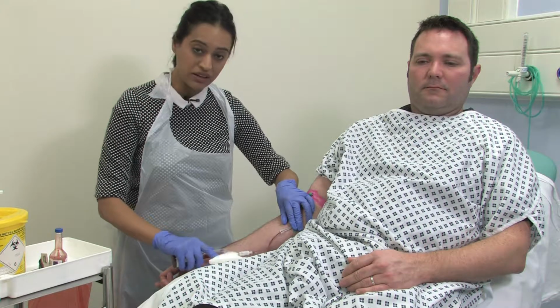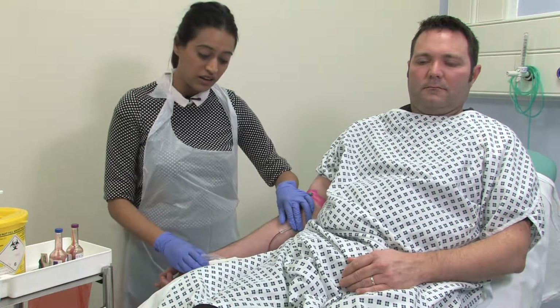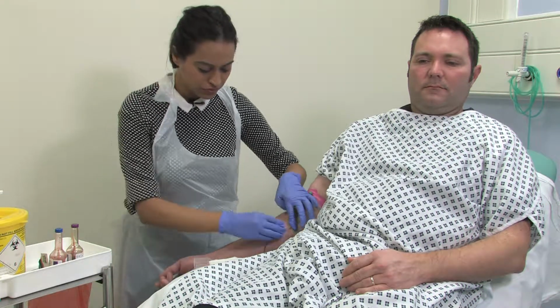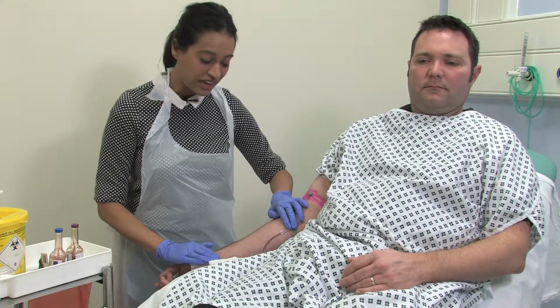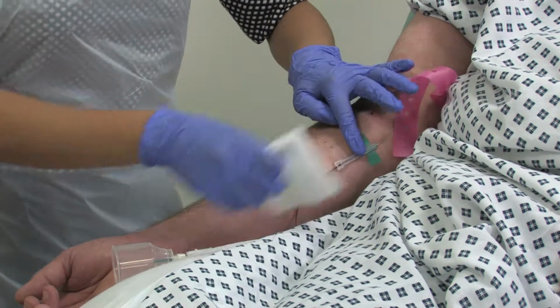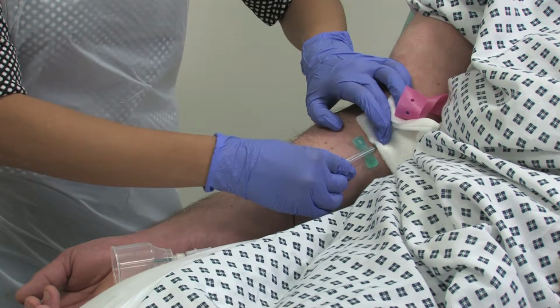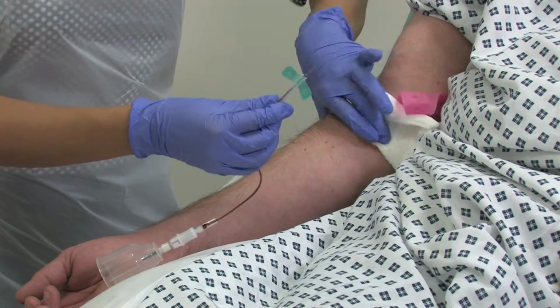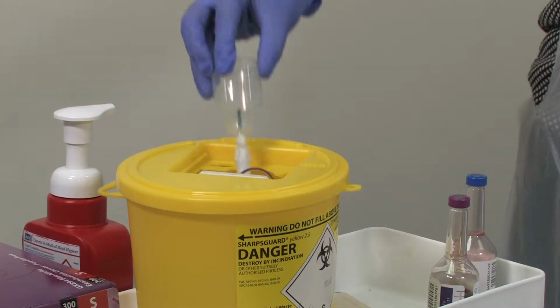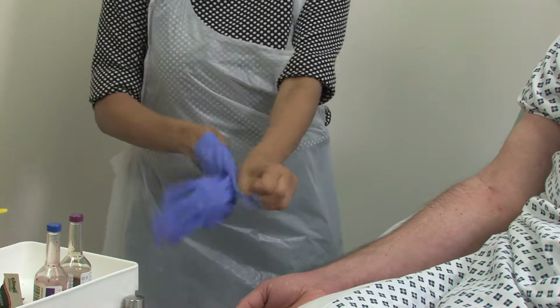Once the blood cultures have been collected, this is the appropriate time to collect other investigations, such as a lactate, which is part of the sepsis 6 bundle. Once all the blood has been collected, it's important that we release the tourniquet, apply some gauze, and remove the butterfly needle. Once it's been removed, it's important that we discard this into the sharps bin with the adapter cap. We can now remove our gloves and apron and wash our hands.